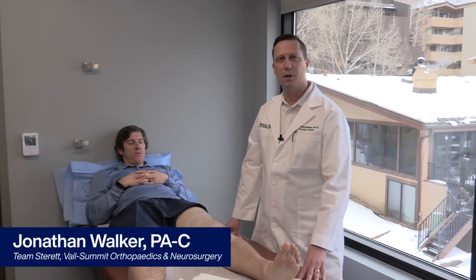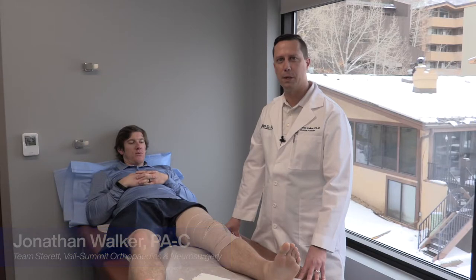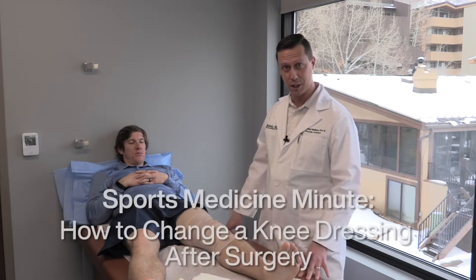Hello, my name is Jonathan Walker. I'm a PA with Dr. Sterrett's practice at Vail Summit Orthopedics. We're just going to do a quick video and show you what our knee dressing changes look like.